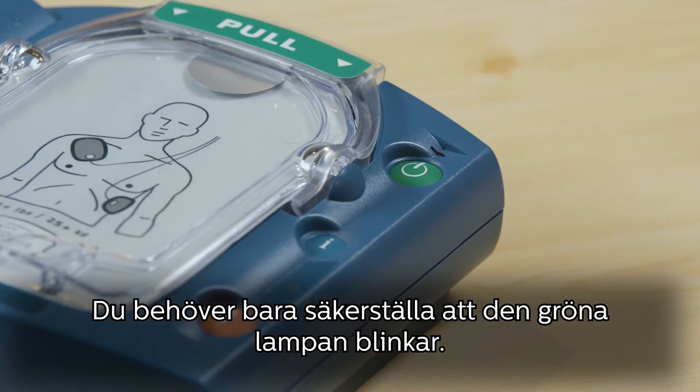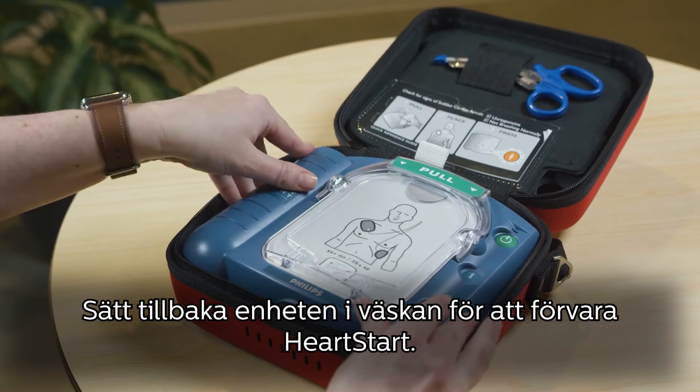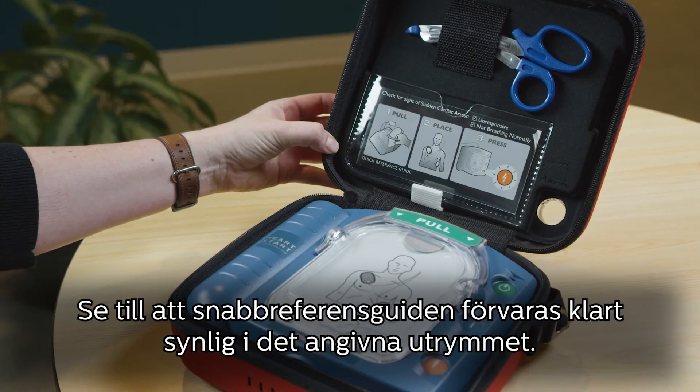All you need to do is make sure this green light is blinking. To store your HeartStart, put the device back into the case and make sure the quick reference guide is clearly visible in the space provided.